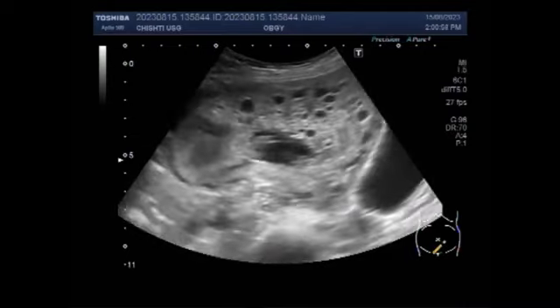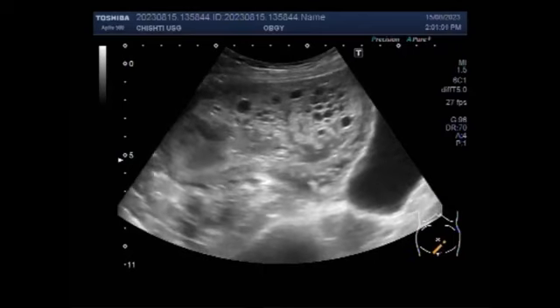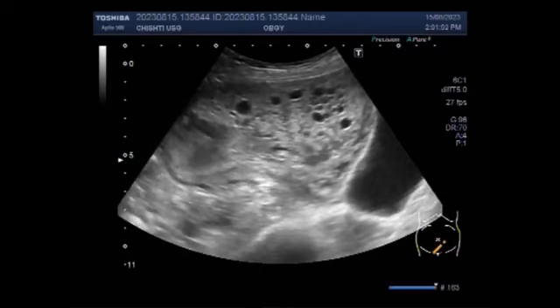Now you can see the molar pregnancy, hydatidiform mole, and further in this video you will see both the fetuses with fetal demise, two gestation sacs, coexistence with hydatidiform mole.